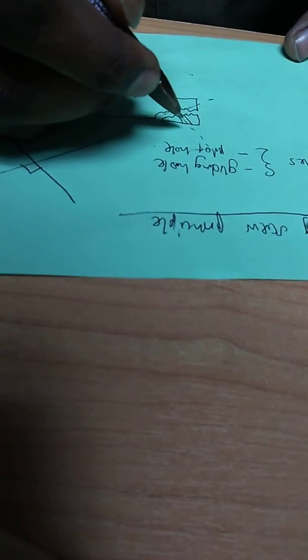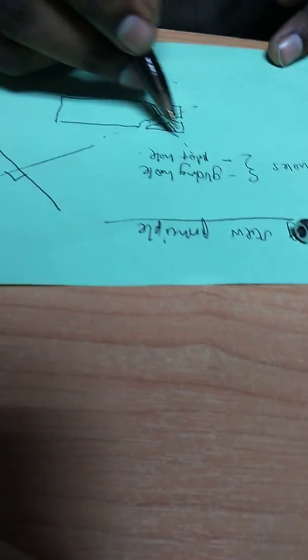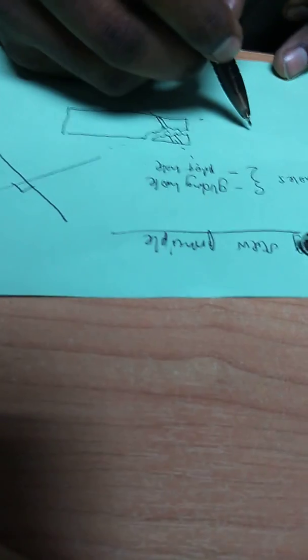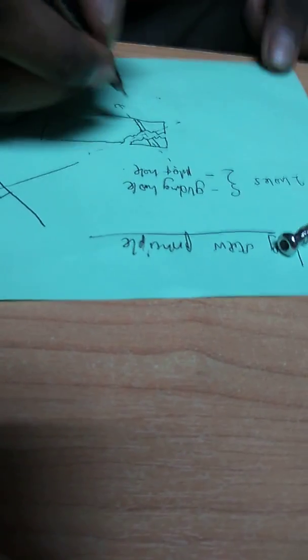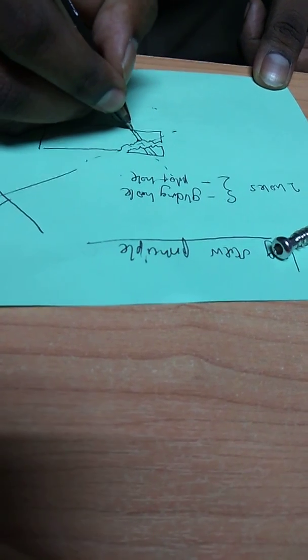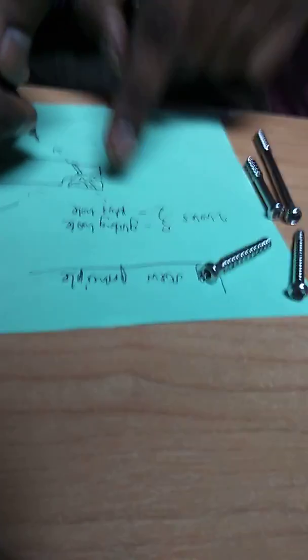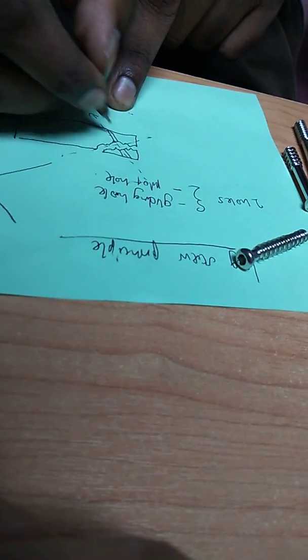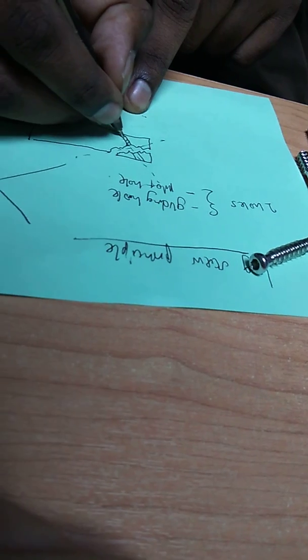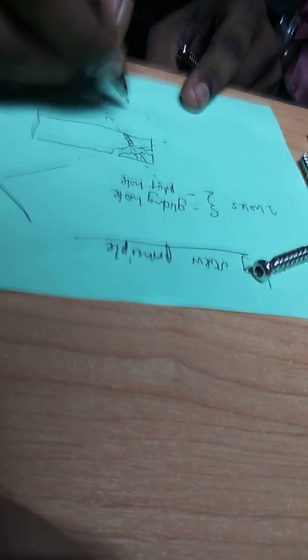Okay, then you're going to place your screw. After you drill, you're going to use a tap. A tap is a device which we use to make thread on the bone. So you're going to use a tap which is of this size for this hole, which is of the gliding hole size, and for the pilot hole. Understand? Okay, so you tap this area. Once this area is tapped, then you place the screw.